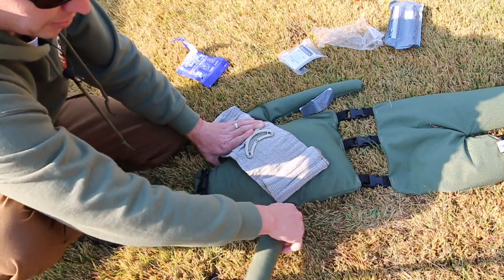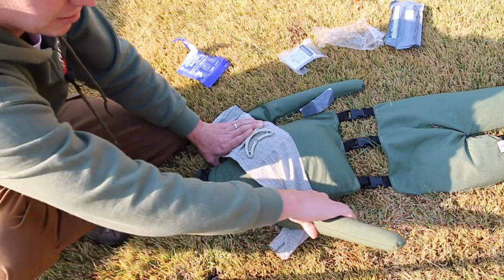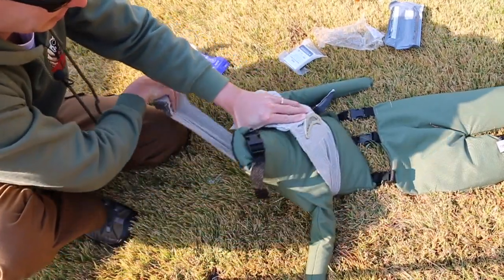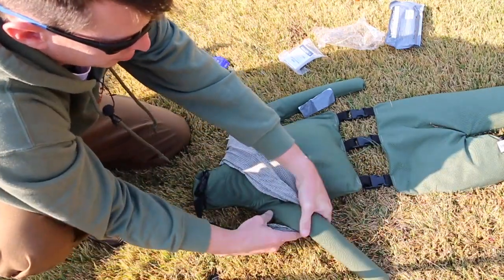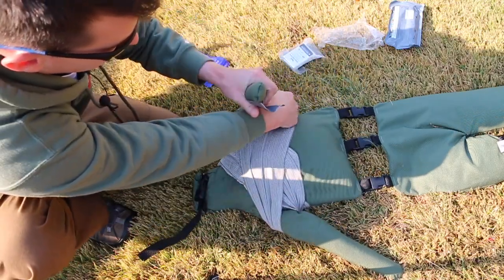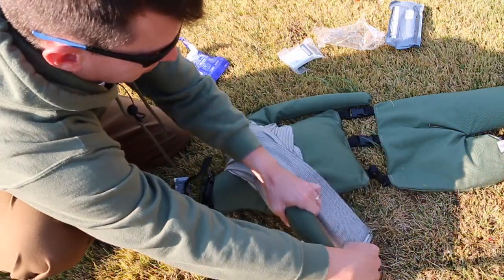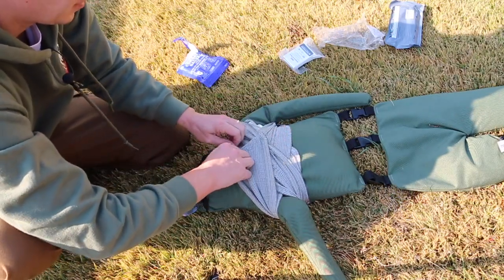So I start here. I normally lift this patient's arm up. This is so when I go up under the armpit, when they lower it down, it will actually pull more pressure onto the wound. So here, you can wrap it around. Now just be careful not to get it too tight because you don't want to impede the breathing process going across the chest here. If you have to, you can go up under the arm, however you want to do this. And then we can secure it.